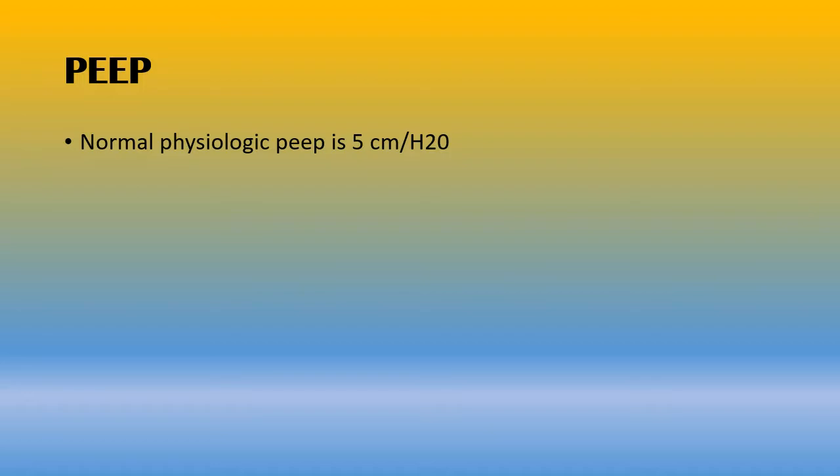People with vent problems, like they're having lung issues, ARDS, CHF, whatever, you may see the PEEP go up to about 10. I really wouldn't feel comfortable taking anybody that has a PEEP over 10 in the C3 environment, because when you get into really high PEEPs, a whole bunch of other stuff starts to happen. You have to change a bunch of other settings. It would just be really hard for somebody that didn't have a really great understanding of all that a ventilator can do to manage a patient with really high PEEP. So most of the time your patient is going to have a PEEP of 5, maybe 6 or 7 if they have a lung problem. Be wary of a patient that you go to and they have a PEEP of 20 or 15 even.